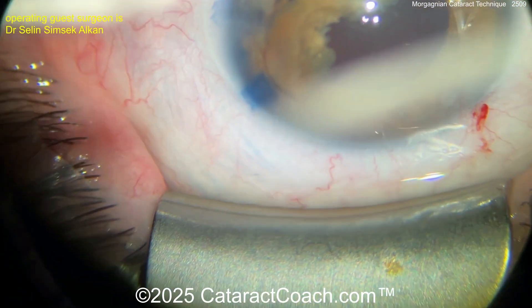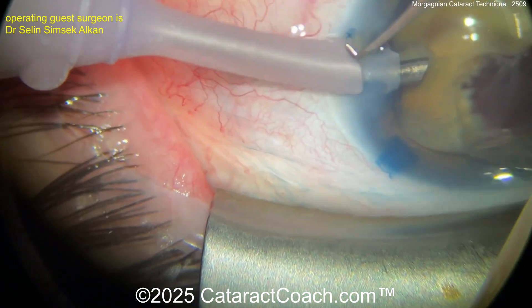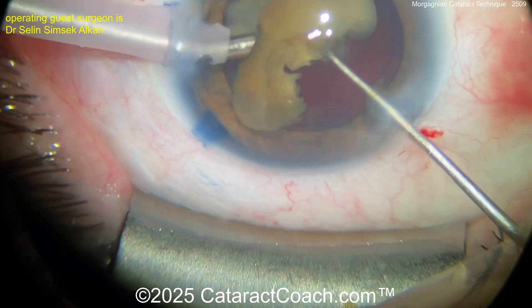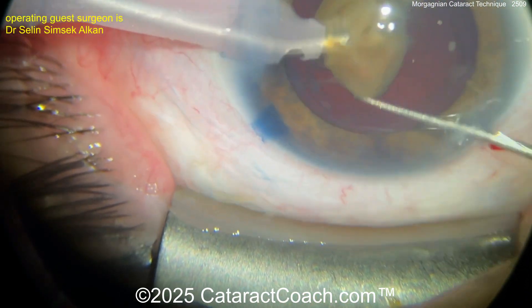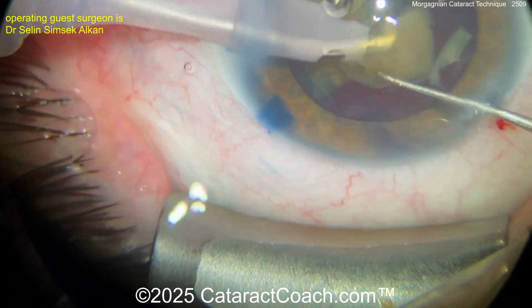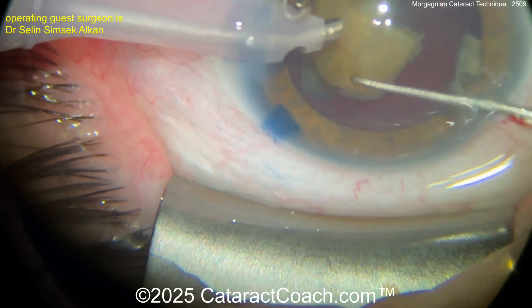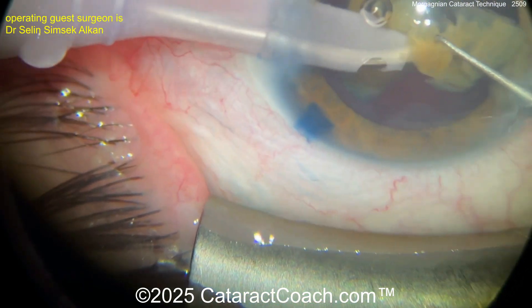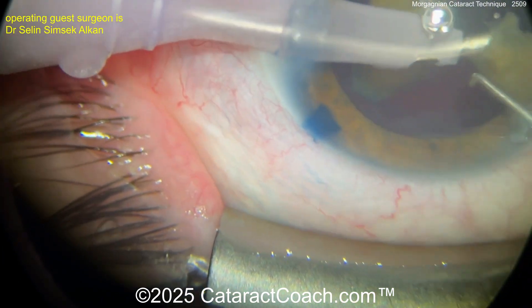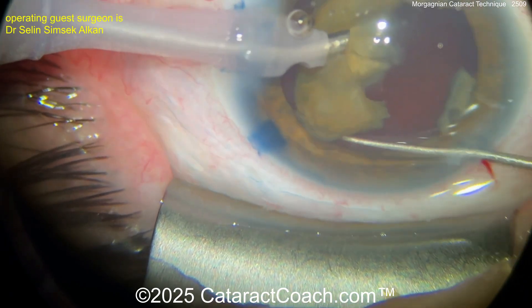More viscoelastic now — I like this idea because you're putting viscoelastic here to protect the capsular bag. You just don't want the probe to come in contact with that. Get the probe in the eye, center up the camera a little bit, and now just aspirate these pieces down. A little bit of phaco energy — they're not super dense. You're using the bigger sleeve too, by the way — that's the purple sleeve, probably a 2.75 or 2.8 millimeter incision. Last couple of pieces going down the port.